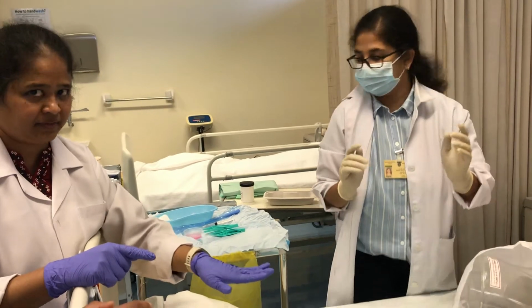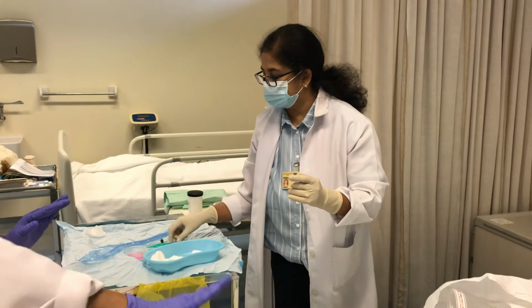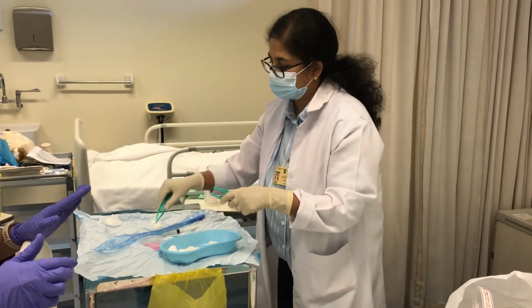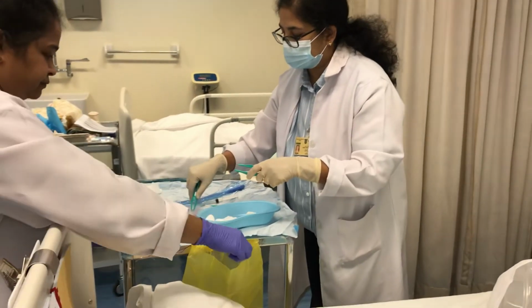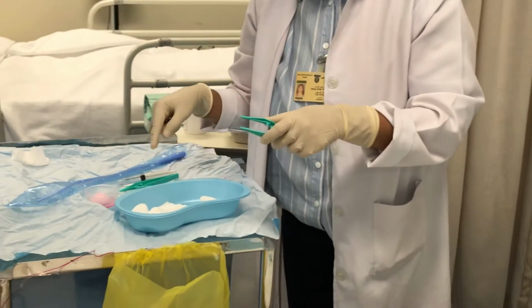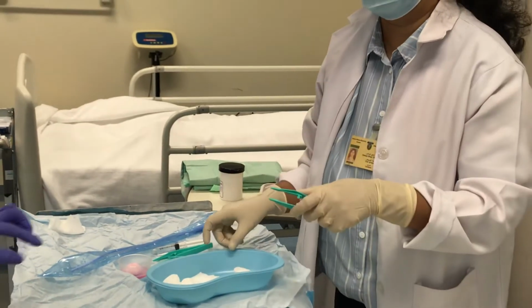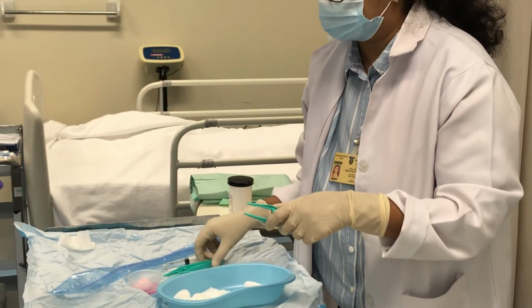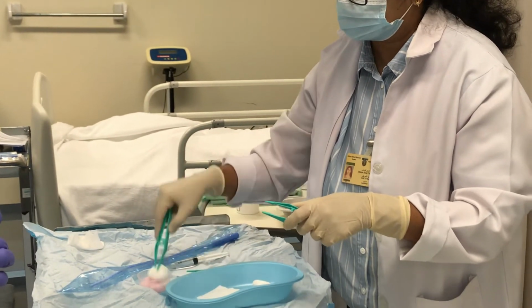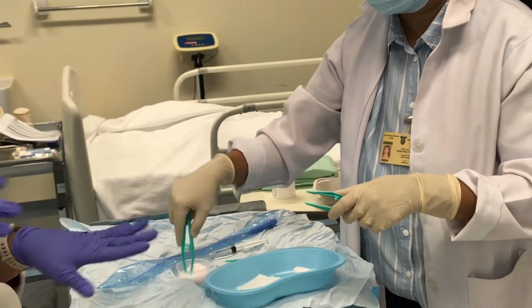But they always give this cover. It's not the right cover. So now what's the easiest procedure? Just like additional sterility we are maintaining. What I'm going to do is dip it and clean. Once we start doing the procedure, we can even use this to keep it there. This is mainly for urine, when you want to put it, you will need it. So throw it here only. We have 5 swabs: labia majora, majora, minora, minora, middle. Correct, 5 they give.